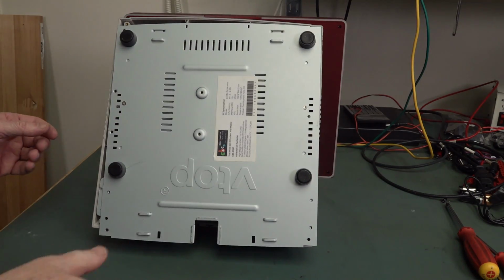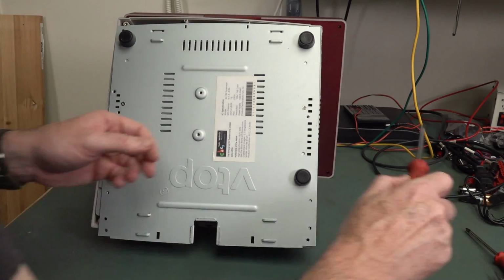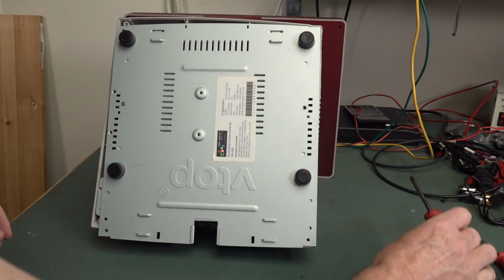All right, I've just randomly taken off all the screws on the bottom, hoping, oh, no, missed one. Oh, hoping that that'll, that's a different type. That's a flathead, unlike all the others. The others weren't flatheads.